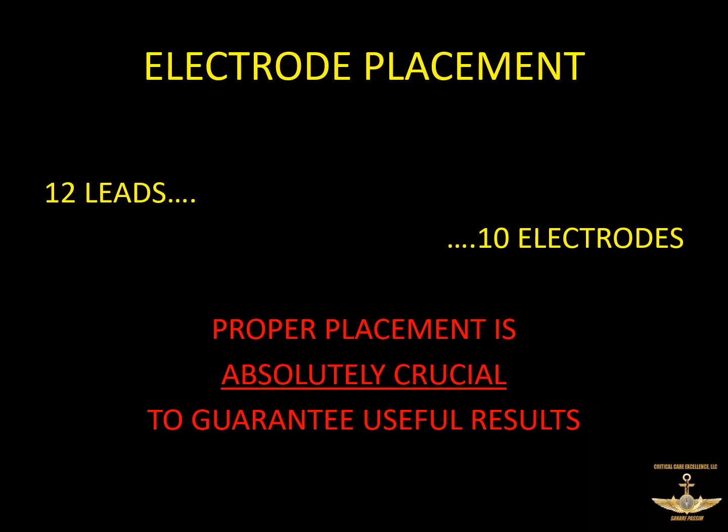And so I would always begin by starting the exact right way and then adapt your practice depending on where you are. Another important thing too is that whenever you put electrodes on, you put them on in the same place somebody put them before, so you get consistent exams.